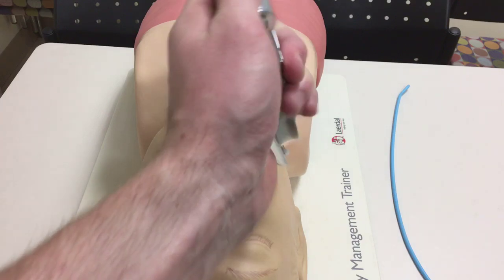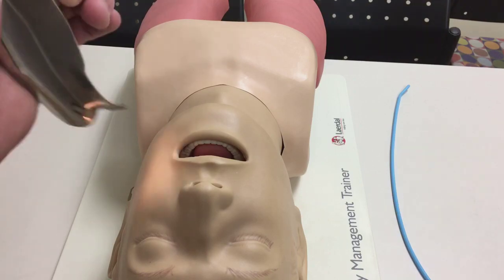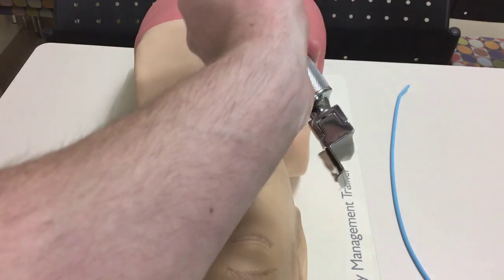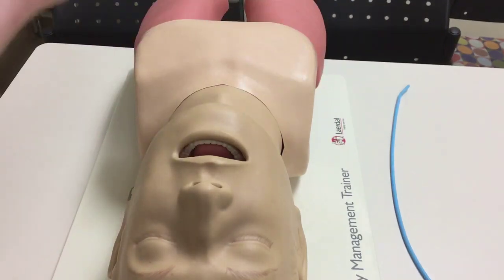Come in from the side and lift — moving the anatomy out of your way to visualize the cords. It has nothing to do with strength; it's all finesse, it's technique. Be low on the hilt. Don't be high up here using your hand to manipulate the blade like a hook. You're literally moving the tongue out of your way.